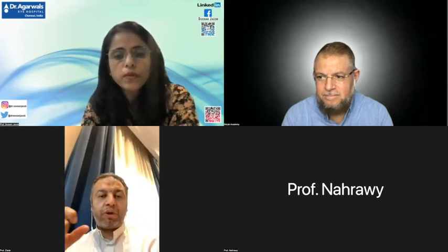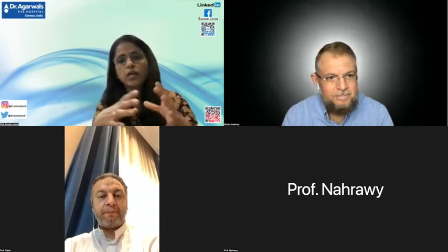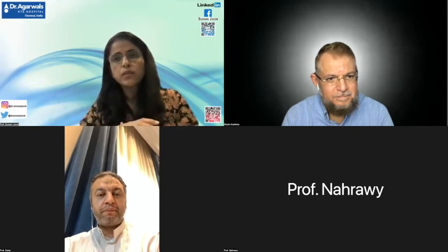Okay, so you think the shallower depth will be more effective than the deeper one in such cases? Yes, because CAIRS does not act exactly in the same way as Intacs. Intacs has an arc shortening effect, which means it's pulling it apart and thereby flattening the central cornea. So CAIRS actually works not just by that. I think the major mechanism of CAIRS is by volume augmentation. So you're putting tissue there and you're augmenting the volume, which makes the cornea flatter there.